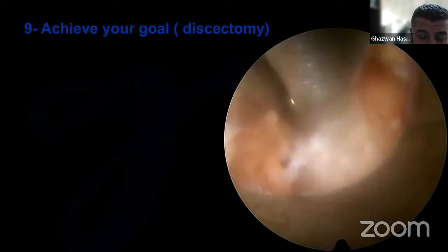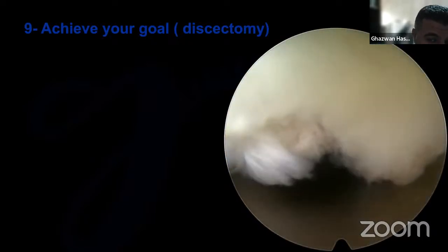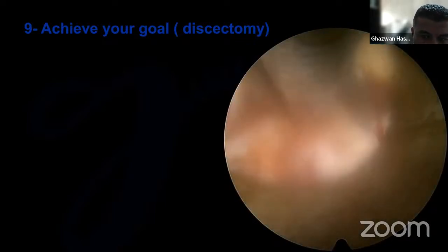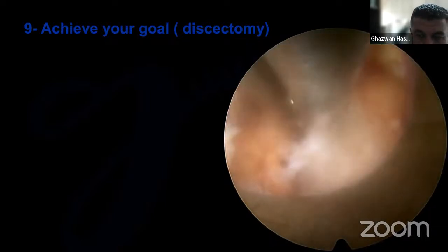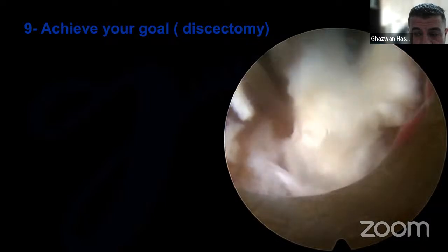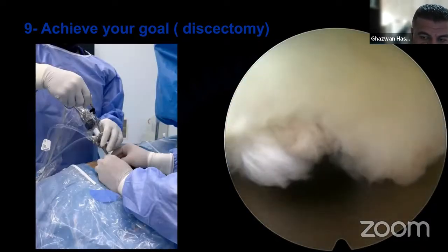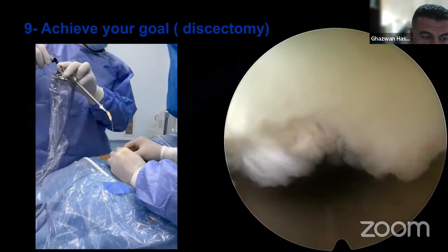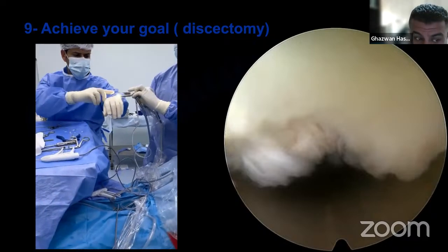Some guys prefer to use the sleeve, and I have this system that has, let's say, the root retractor, so I can use it and then introduce the instrument, which gives me more confidence and less traction on the nerve root, and finally achieving the goal by simply removing this big disc, and you will feel the dopamine surge when you remove such a big disc as one piece.